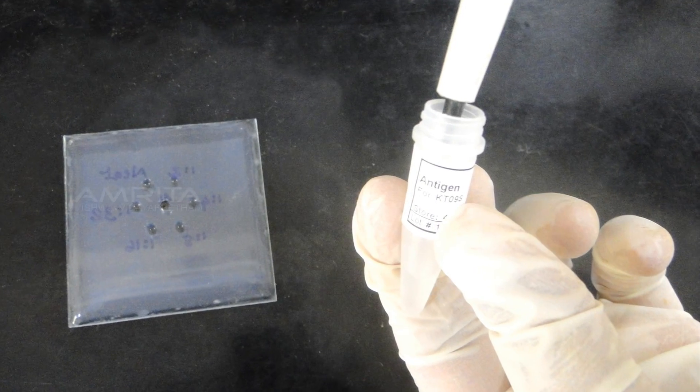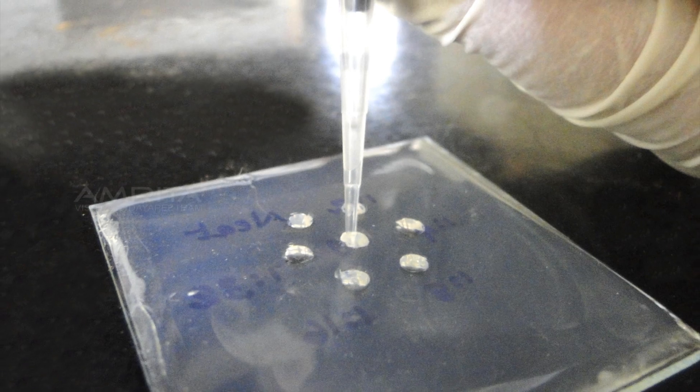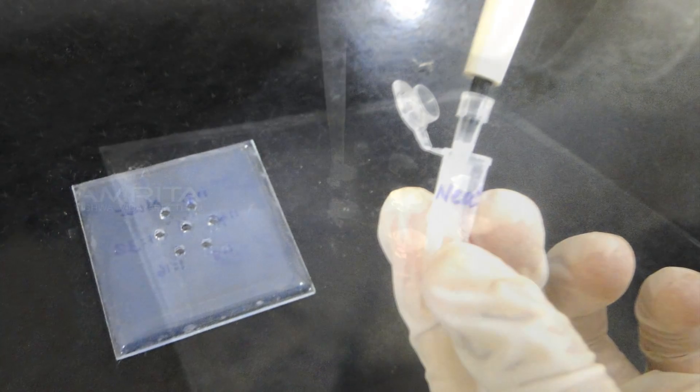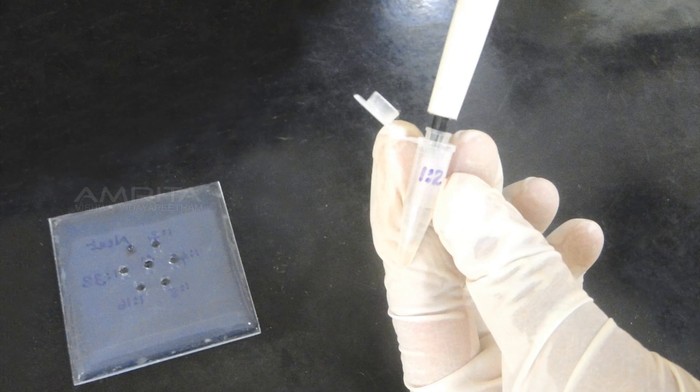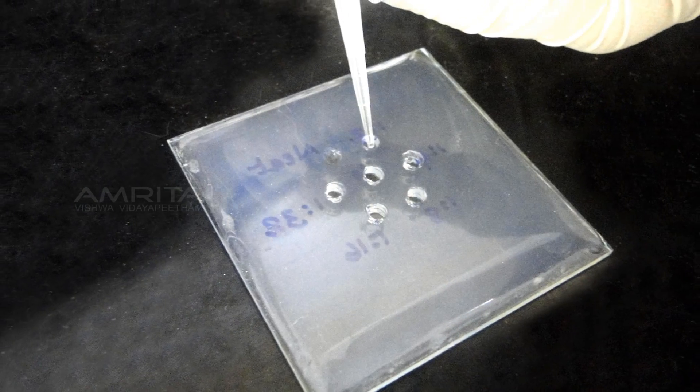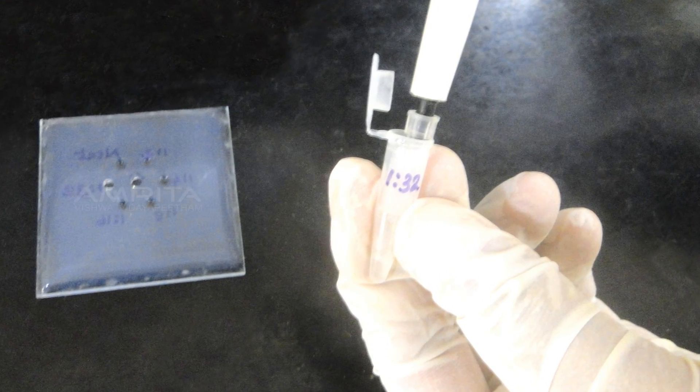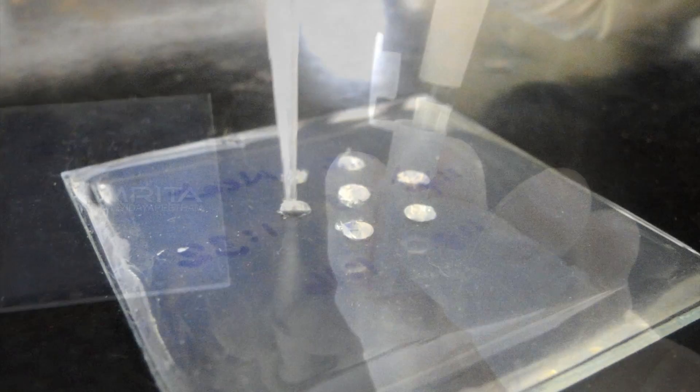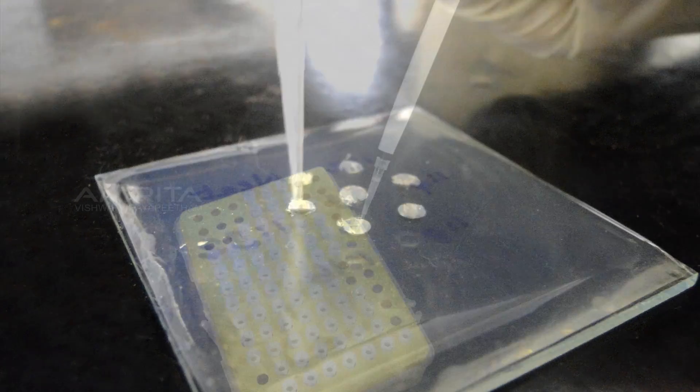Add 10 μL of the antigen to the centre well and 10 μL each of neat undiluted, 1:2, 1:4, 1:8, 1:16, and 1:32 dilutions of antiserum into the surrounding wells. Use a new tip each time.